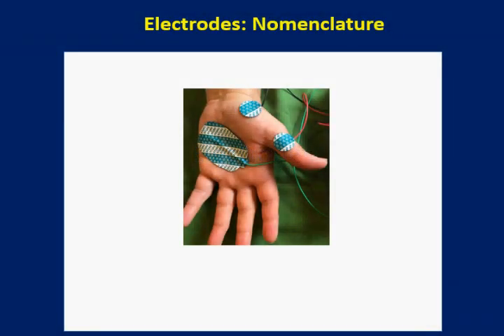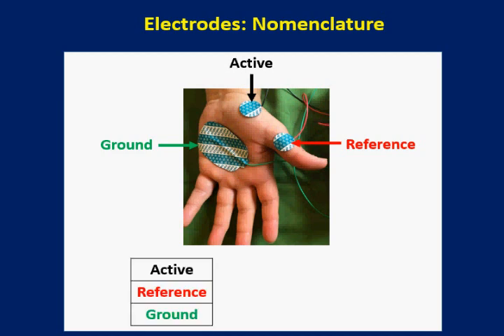The electrophysiologic potentials are recorded using surface as well as invasive electrodes. 3 electrodes are required to record from a site. They are called active, reference, and ground. The reference electrode often conveys the impression that it does not record any electrical activity. That is quite wrong. Hence, we refer to the electrodes as E1 for active, E2 for reference, and ground.